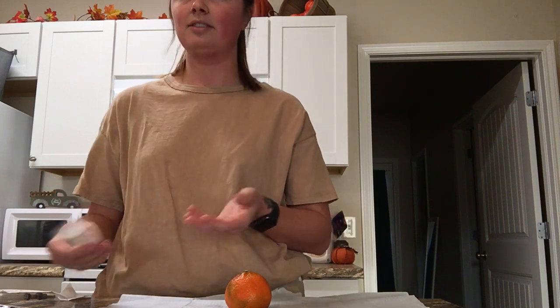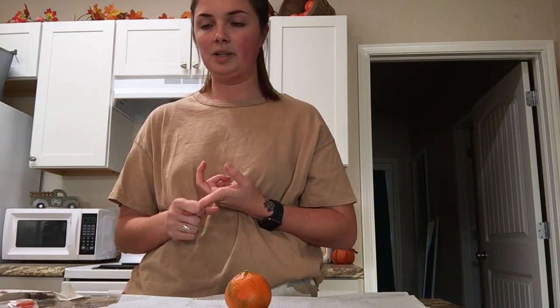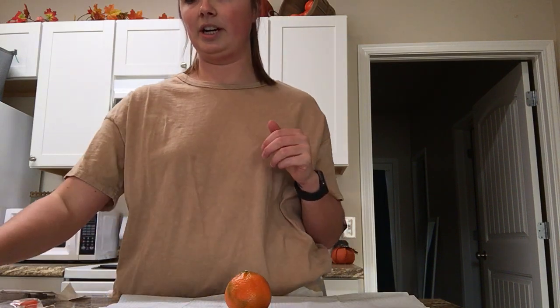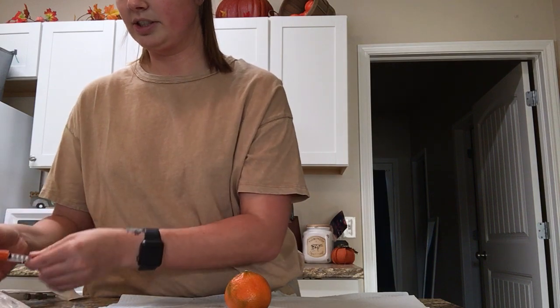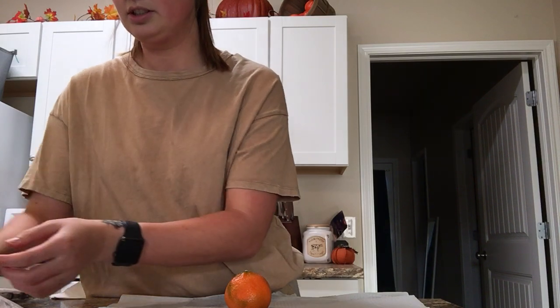So since the patient is diabetic, I'm guessing they've taken insulin before, so I don't think we really need to ask that. So I've verified my patient, verified my medication administration rights. Now I'm going to do my hand hygiene, put my gloves on, and then I'm going to get ready to inject or set my injection up. So I'm going to take this off, set it on a clean surface.